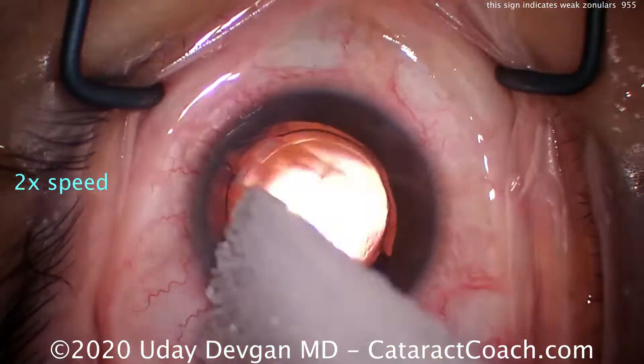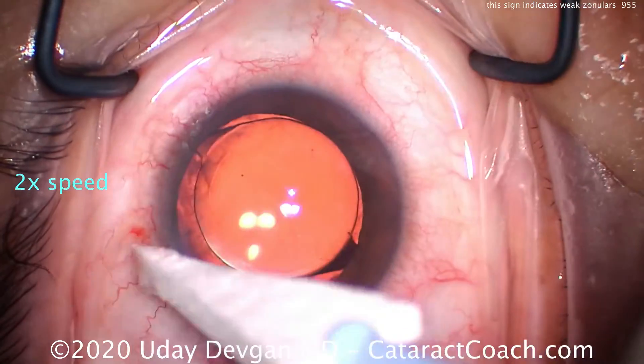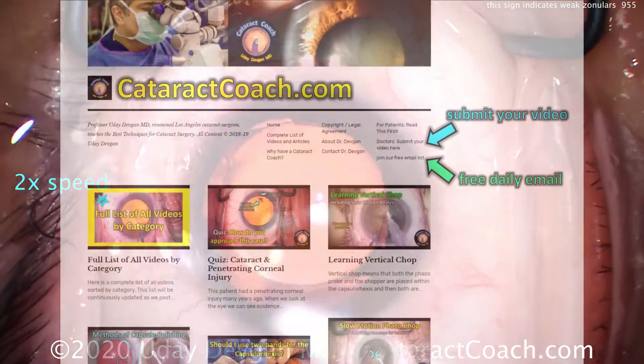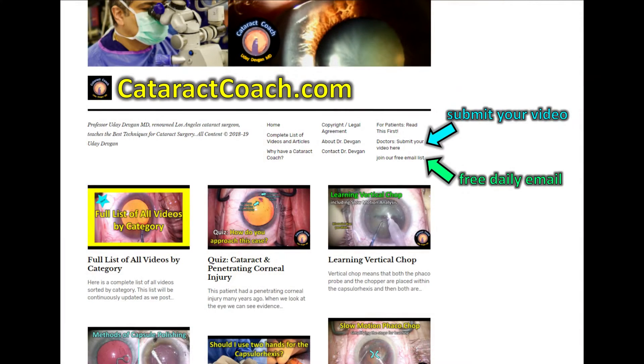At the end we've got a nice overlap of the rhexis on top of the optic, and the patient's going to have a beautiful outcome. Tune into cataractcoach.com — I'm giving you all the secrets and subtleties I've figured out over the last 20-plus years, and I'm going to teach them to you, totally free.